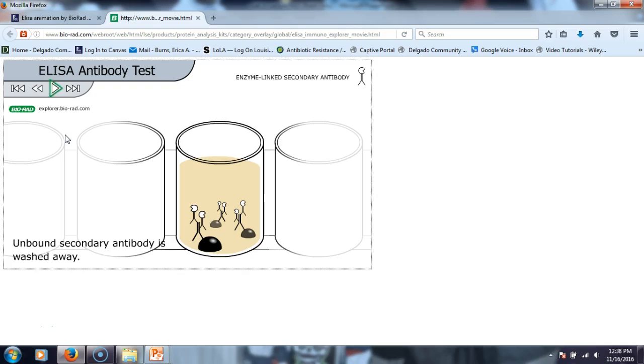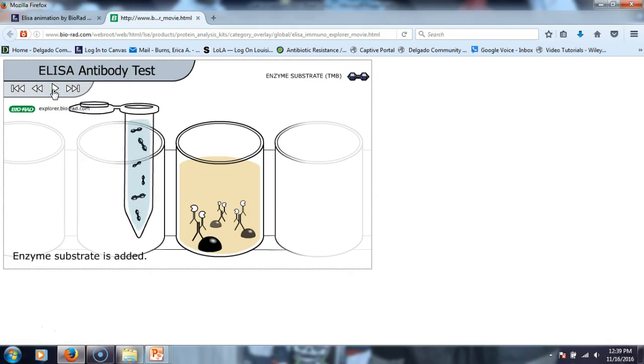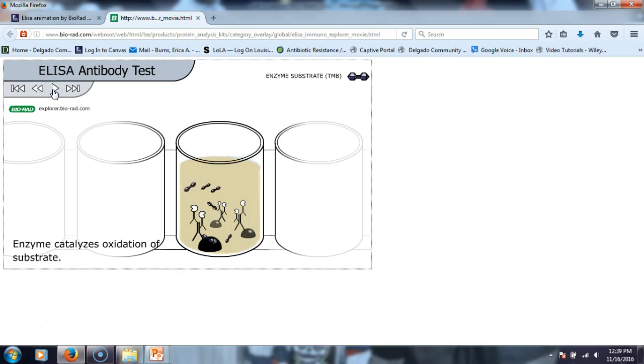Well, these are proteins. They're submicroscopic. Are you going to see any of these in your wells? No. So we need something to see. We're going to add a substrate that's pretty much colorless. But when you add it, that enzyme, that little Pac-Man, is going to cause an enzymatic change in that substrate, and it's going to turn, anyone know? Blue. It's going to turn blue.